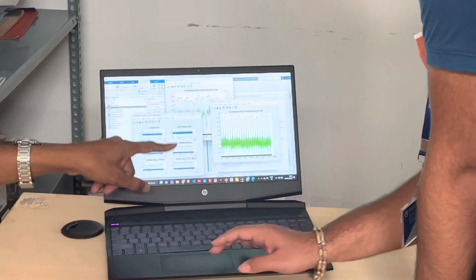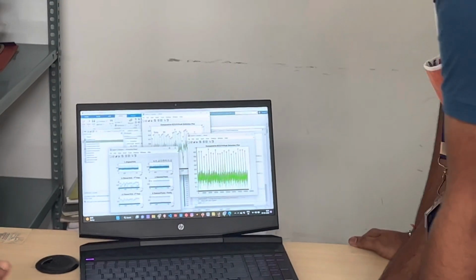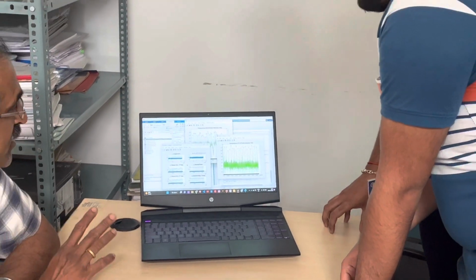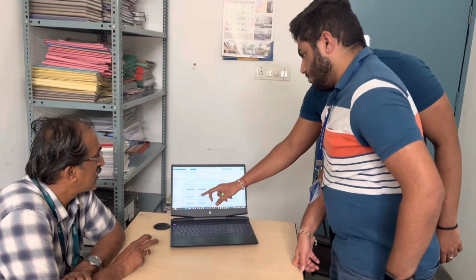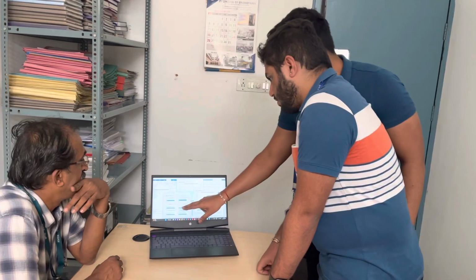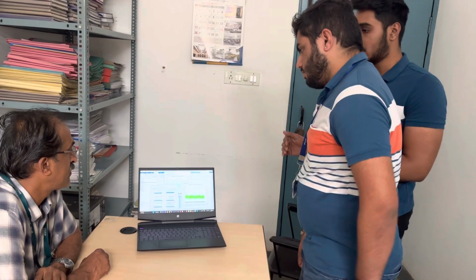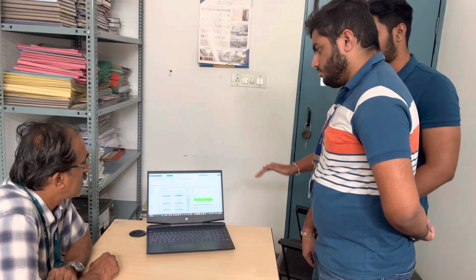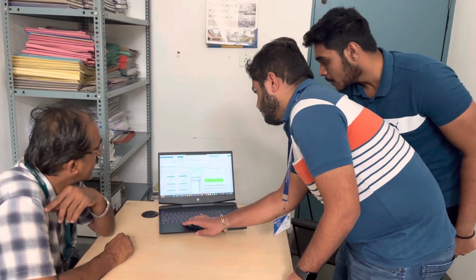You made uniform magnitude, right? On what ground did you make it uniform magnitude? Did you remove any low frequency components? Yes sir, we are filtering low frequency components using rectangular windows. Have you put any threshold for that? No sir, the threshold means the rectangular window we are using from 0 to 1. This is the rectangular window height. Usually if an R peak is greater than 0.4, it is detected as an R peak. If it is less, it is detected as a low frequency component and it is removed.